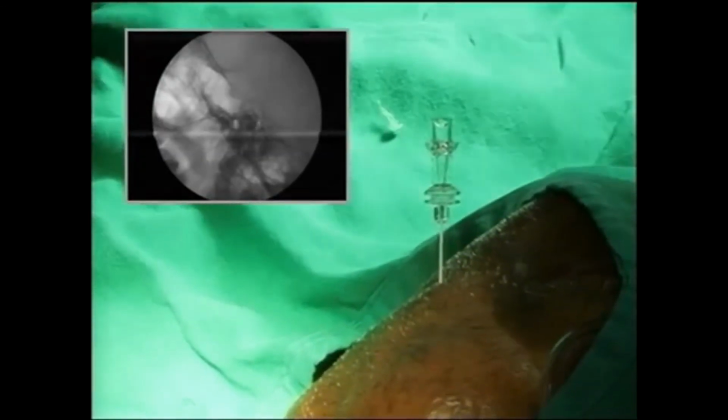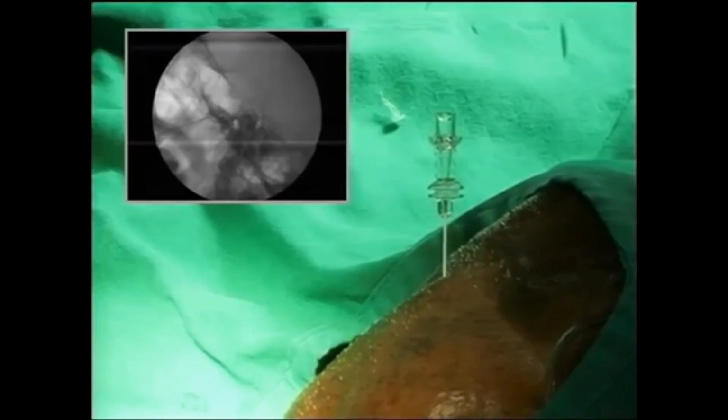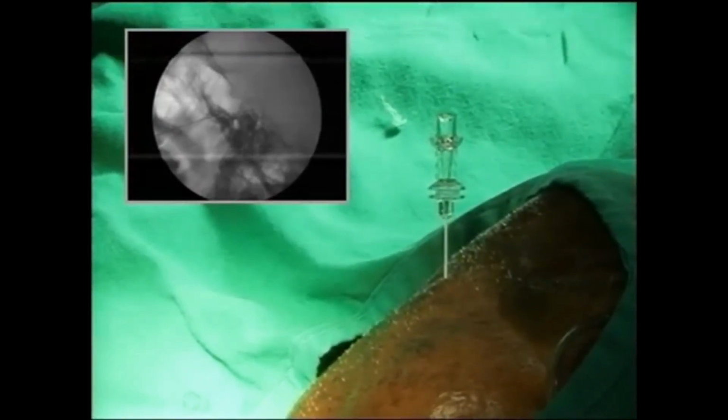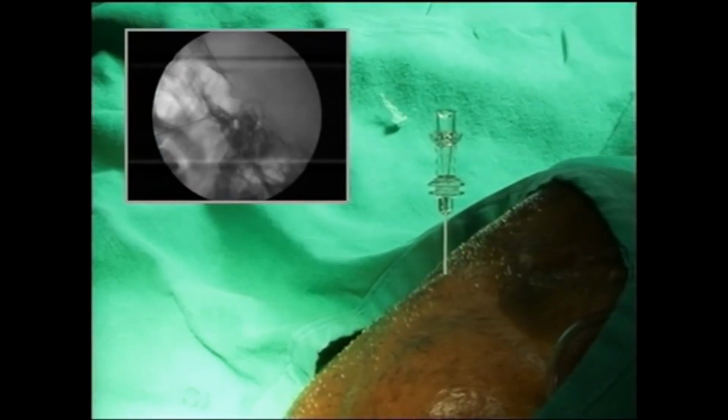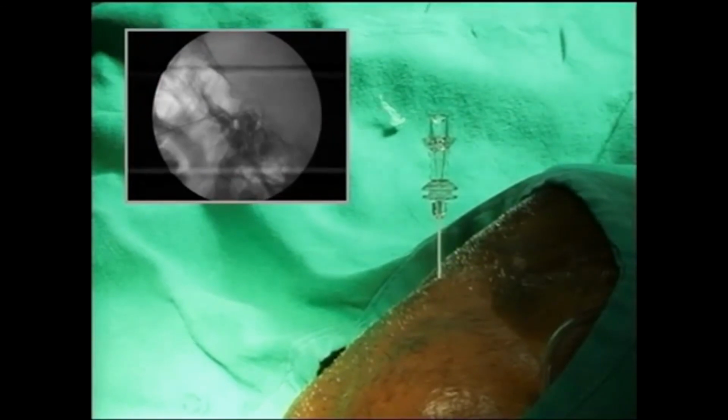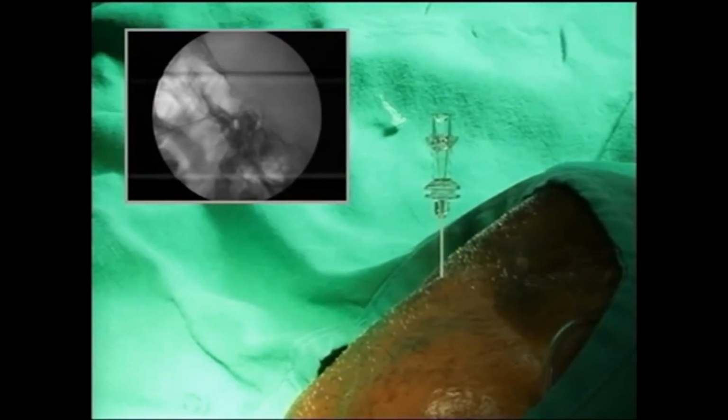Okay, so more sedation for the patient, and then I'm going to do the RF ablation. Okay, if the next patient is ready, you guys can start. I'm going to do the RF ablation at about 60 degrees centigrade, 65 and 70. I'm going to do about 4 lesions because he's been having this problem for some time, Karthik.